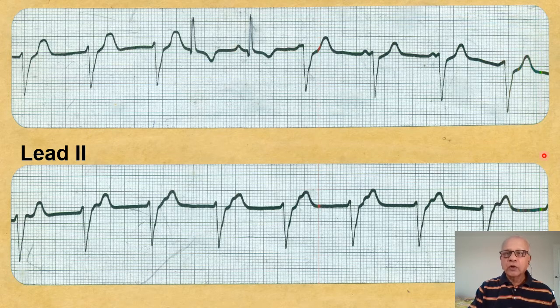Or what you can do is you can do a pacing. You can put a pacemaker into the ventricle and do a pacing for the patient, which will override the abnormal rhythm and help the patient. So these are the methods. I hope you understood. There were 4 questions here. So we'll go on to the next slide.